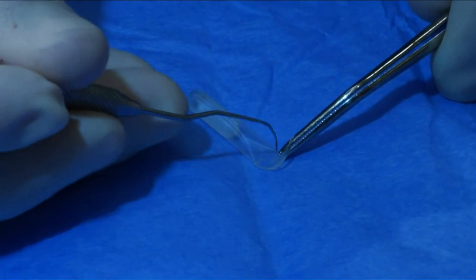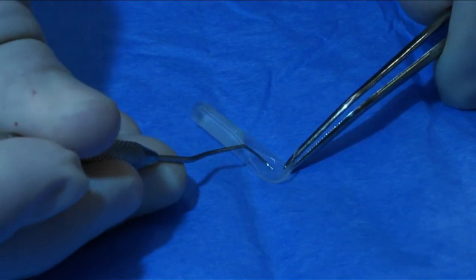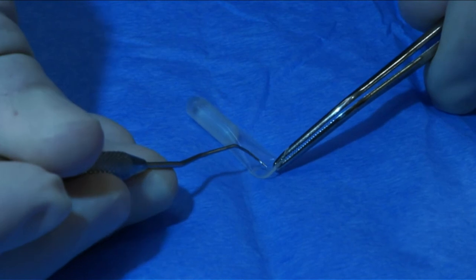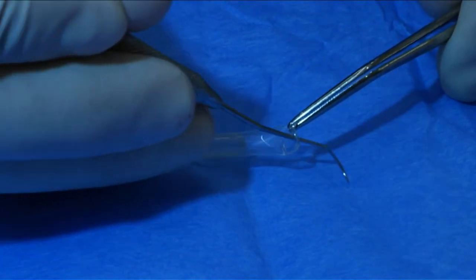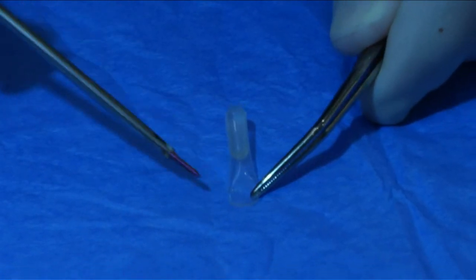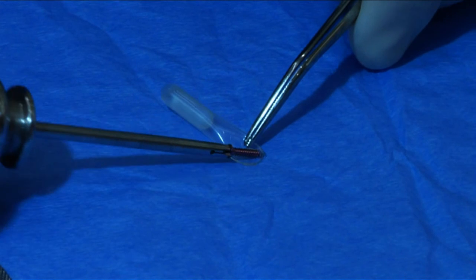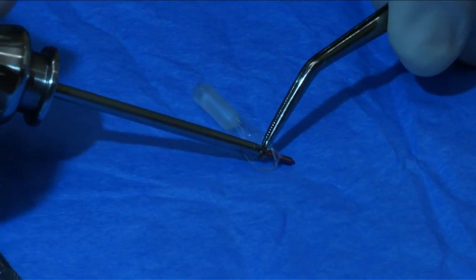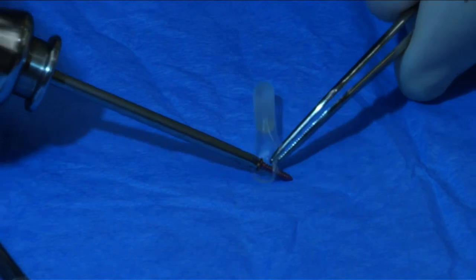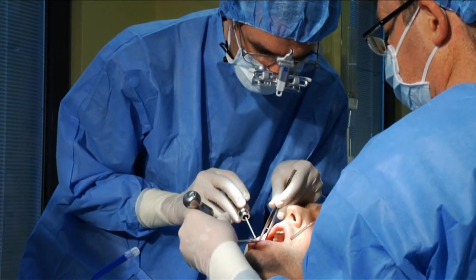The expander is fixed with a bone fixation screw, and that's why we perforate the expander's strap here. And a bone fixation screw is put into the hole. And then the expander is transferred to the pouch.